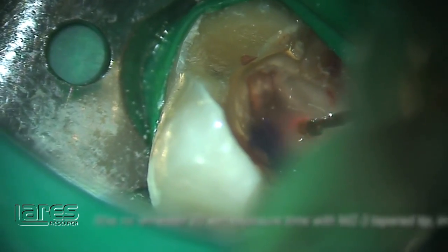Here I am going into the mesial buccal 2, and I'm going to fire the laser and look at everything that comes out of the MB-1. If you look long enough, you'll also see little pieces of nerve tissue and debris coming out here — watch, you'll see it float here in a minute, like right about here.